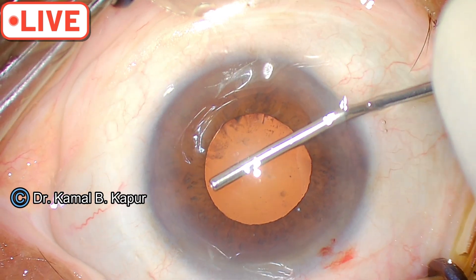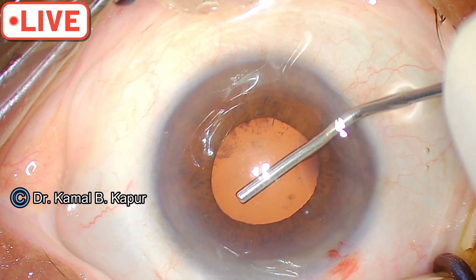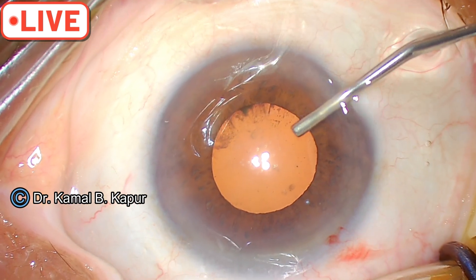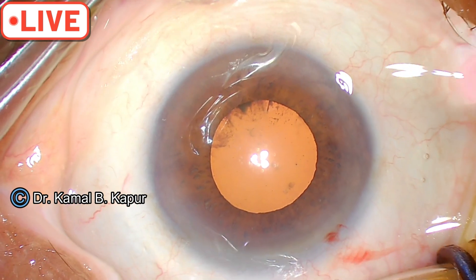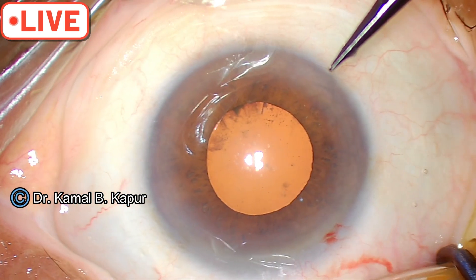The trick is to first fill in the viscoelastic in the anterior chamber. Then put some amount of viscoelastic behind the iris to lift the iris away from the capsule. Then we create micro small sphincterotomies.